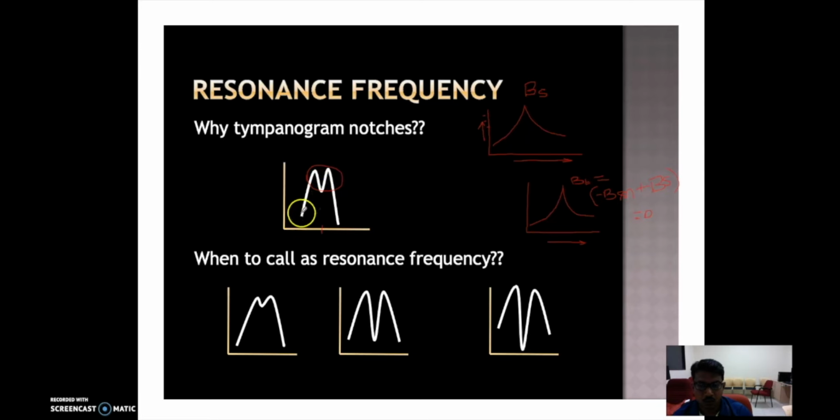Why is there not a decreased contribution by B at other pressures? Because we are either increasing or decreasing the pressure relative to the zero or static pressure. In this graph, we are inducing additional pressure on the tympanic membrane by artificially biasing it as a stiffness dominant system.